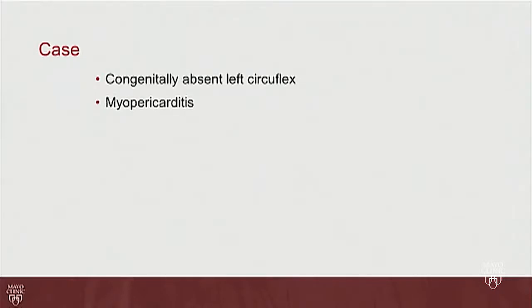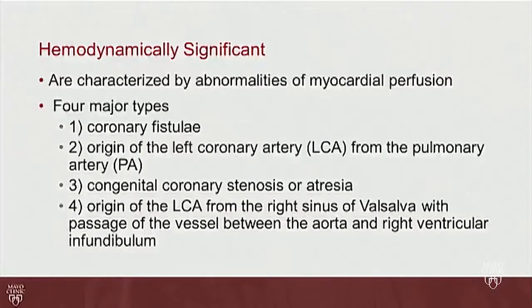So we actually did an MRI, which proved that she had myopericarditis and again showed that she had a congenitally absent left circumflex coronary artery, which was our diagnosis from the cath lab.